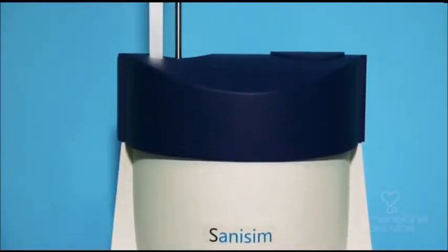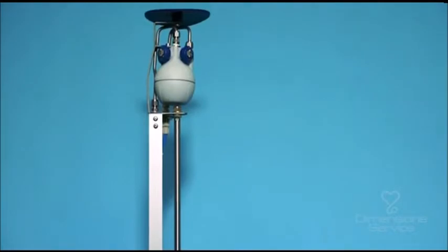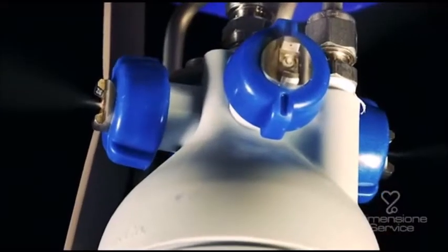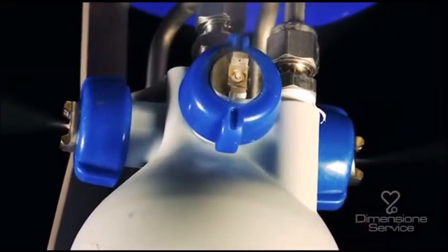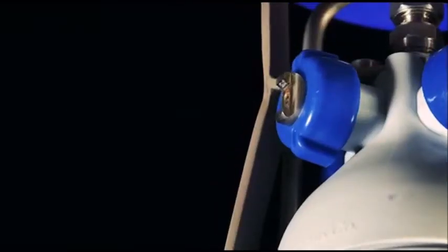At the end of the process, it is necessary to wait for at least 15 minutes to allow the sanitizing liquid to act correctly. It is possible to stop the process for any kind of emergency by pressing the red button located on the back of the device.